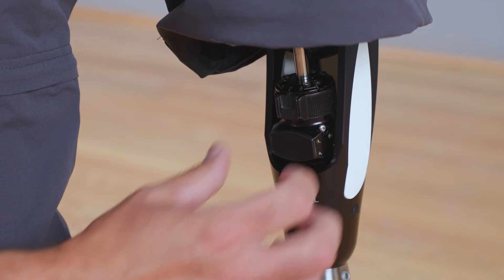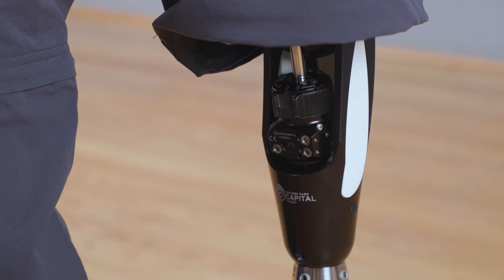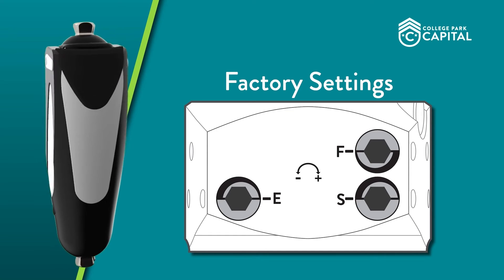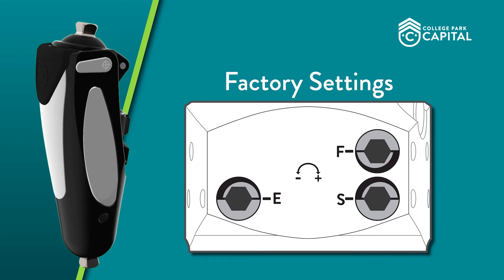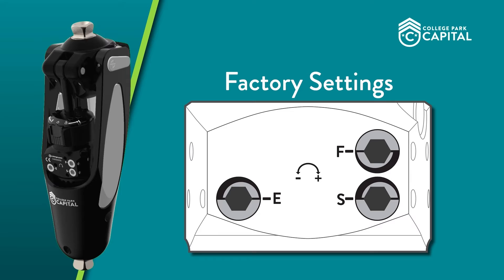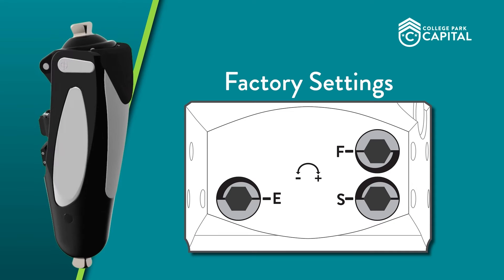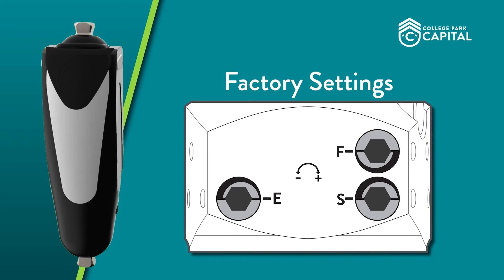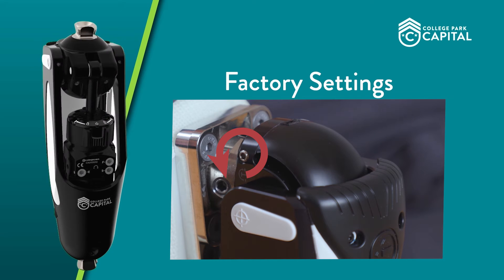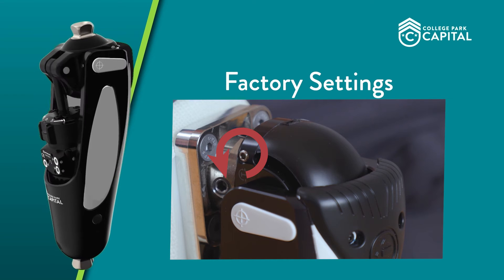Before completing the dynamic alignment of the Capital, restore all adjustments to the factory settings, as this will be the best starting point for dynamic fitting. F should be at minimum setting, turned all the way counterclockwise. S should be at maximum resistance, turned fully clockwise. The factory setting for extension resistance E is minimum, or fully counterclockwise. Lastly, the stance trigger resistance T should be at its most sensitive, turned fully counterclockwise.